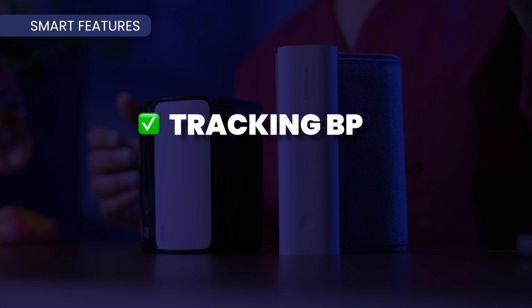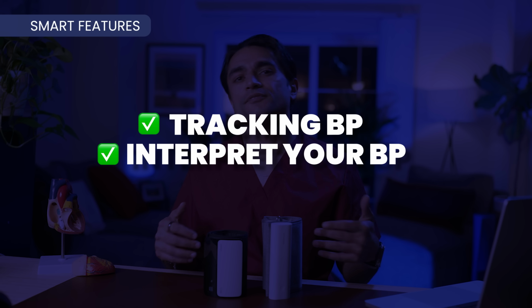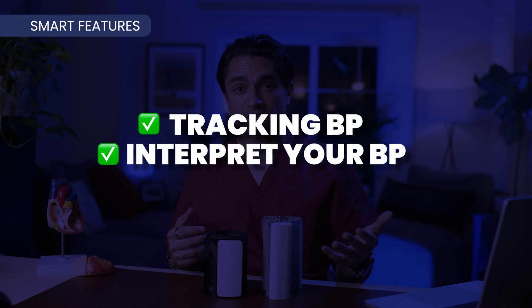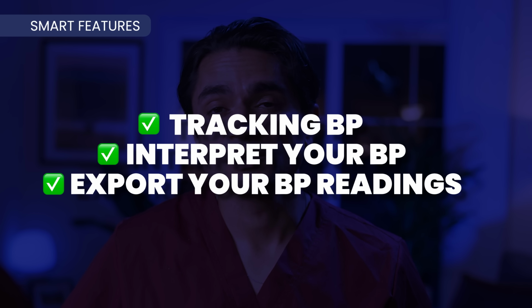Both Withings and Omron's apps are great for tracking blood pressure through both a list of readings and graphs. Both of them interpret your blood pressure readings for you, letting you know if they're normal or what stage of hypertension they're classified as. You can also export your blood pressure readings that you can share with people like your doctor, your nurse, or family members. The Withings app shows the minimum and maximum readings, and the Omron app lets you filter readings by whether they were taken in the morning or evening.